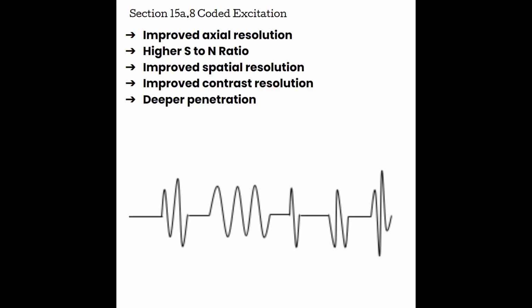And then as the echoes come back from this long pulse, the machine can kind of match up those little bits of pulse with one another and then figure out how to place them and how to make a really nice picture from them. So even though the pulse itself is really long, it is made up of those really short coded pieces, and because of that we get an improved image without having to send out multiple pulses.